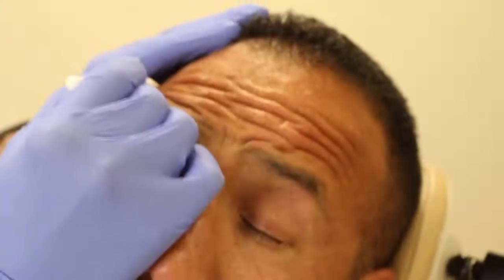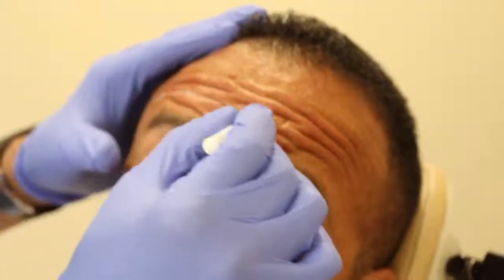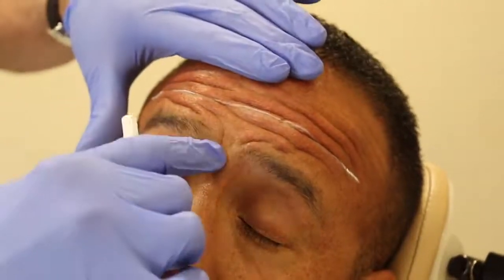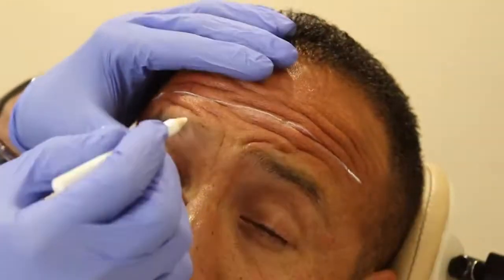I'll have the patient lift up his frontalis muscle, and I'll draw a line just below the middle, which will mark the superior limit of any corrugator toxin injections.